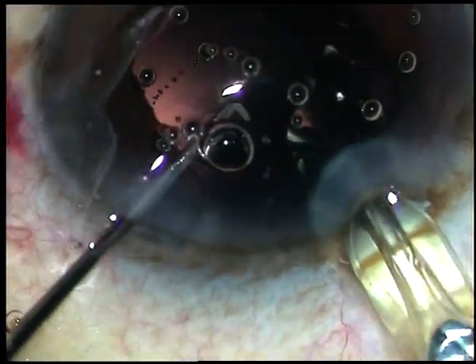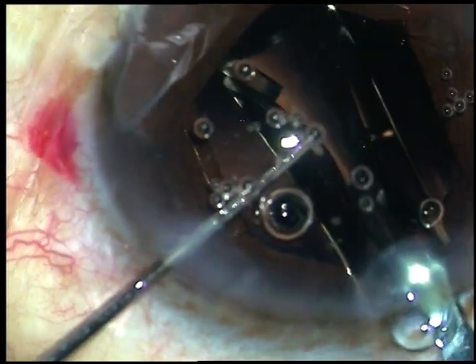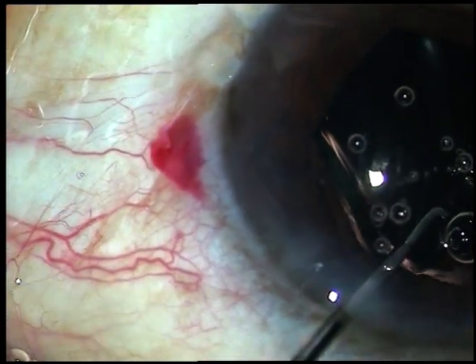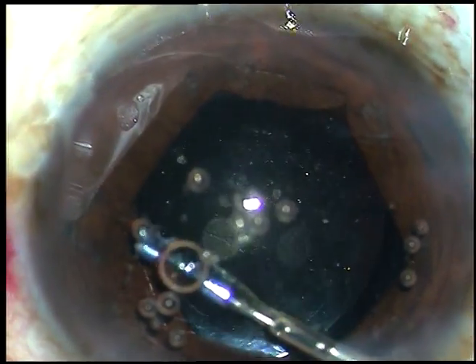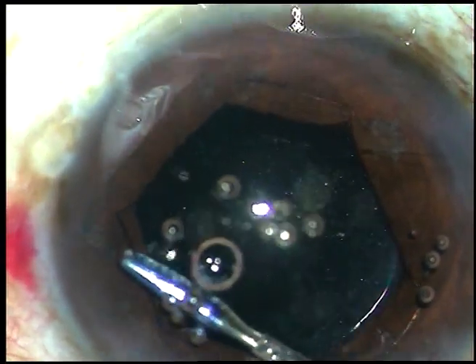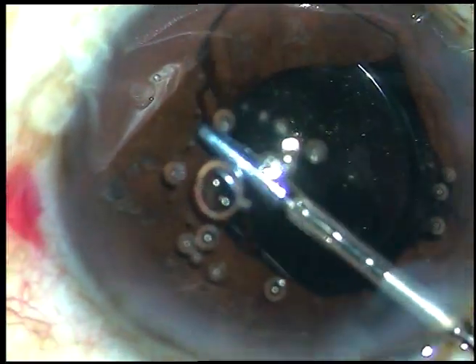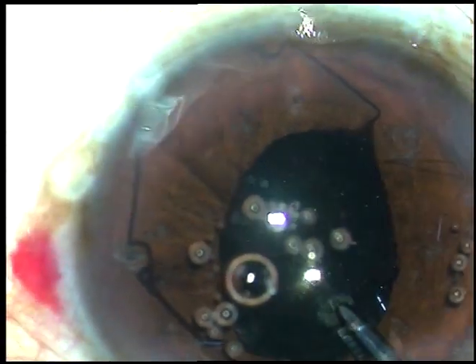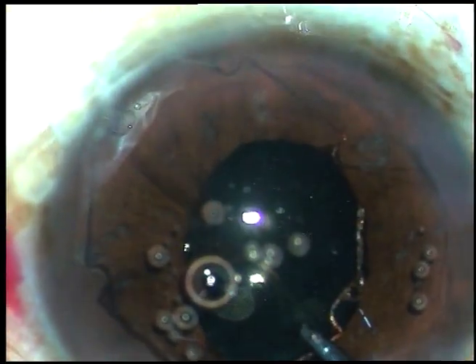Then you implant the intraocular lens. Dial the lens so that it is in proper position. Then hold one of the flanges above the iris, untuck all the flanges, hold the flange just in front of the main incision, and pull it out.